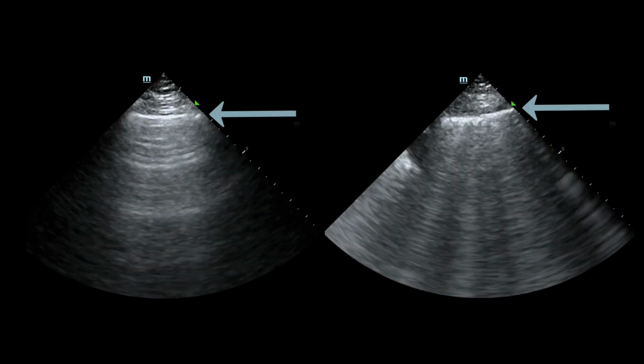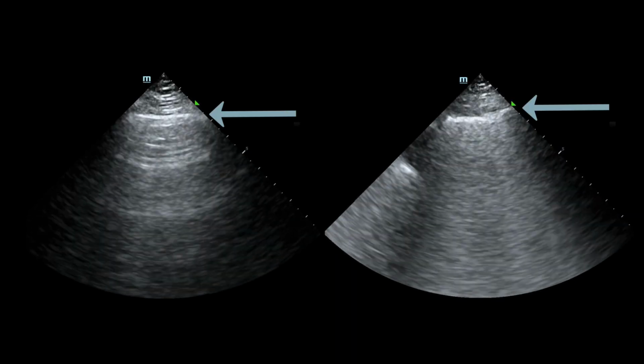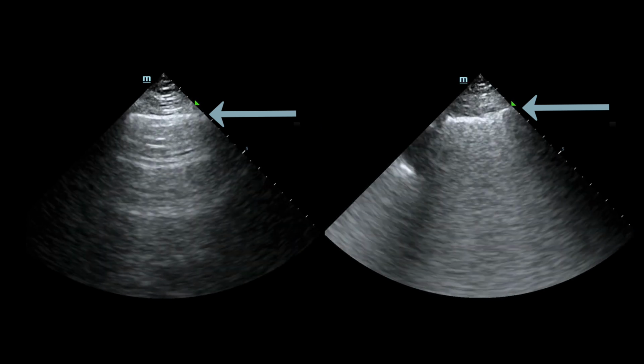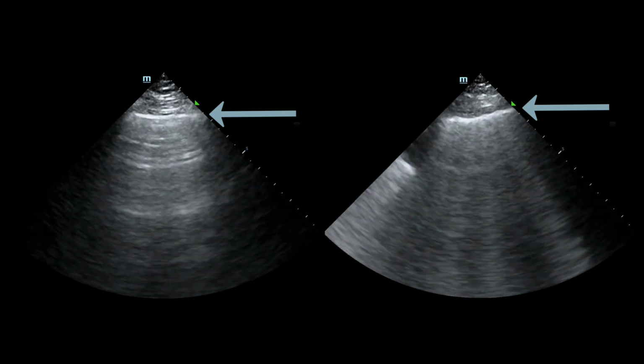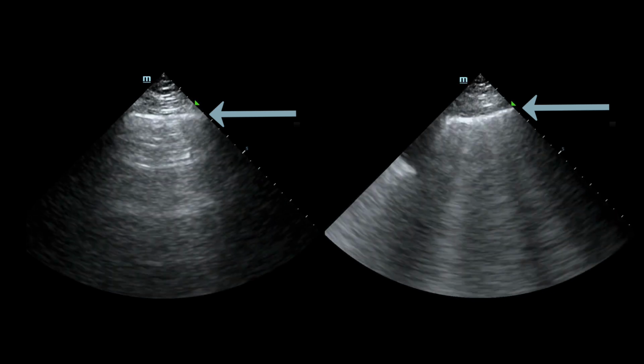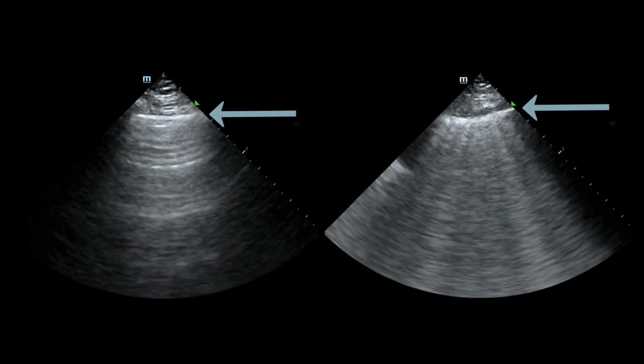If that doesn't do it, I switch to using a linear probe for higher resolution imaging so I can take a close look at the pleura to assess for sliding. Here are a couple of images I've captured of normal pleural sliding, where we can see the two layers of pleura sliding against one another just below the ribs. For now, keep your eye focused on the pleural line and don't worry about the artifacts you see below the pleural line. We'll cover them in another video.